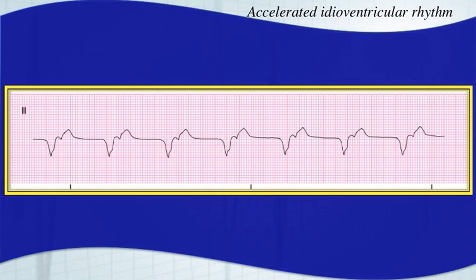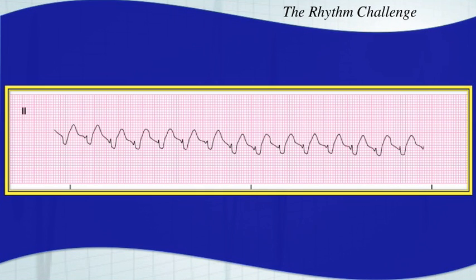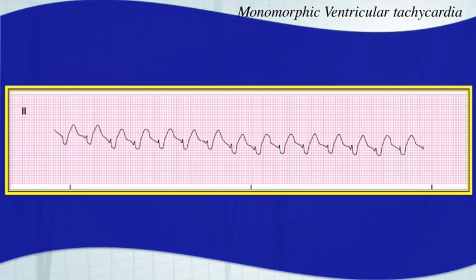Here's your next one. Make sure you hit pause and try to interpret this. This is a monomorphic ventricular tachycardia. You can see it's very fast, much faster than 100. Wide QRS complexes — your QRS complex starts about there and ends right about there. That's a wide QRS complex. It's ventricular tachycardia.